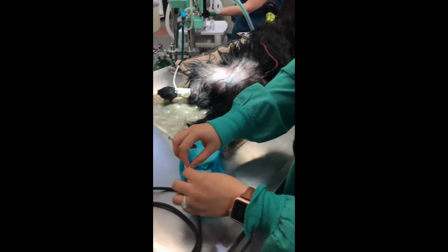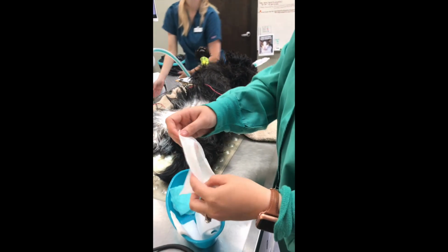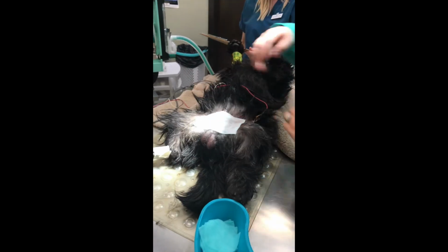We're going to just lay a piece of alcohol gauze over the incision so it doesn't get contaminated during our movement to surgery.